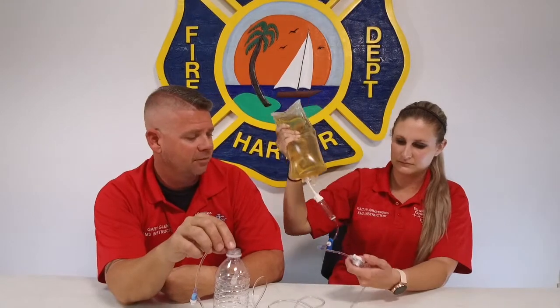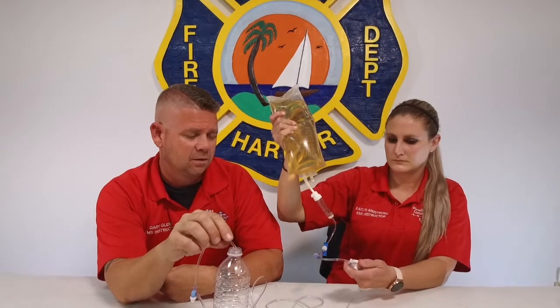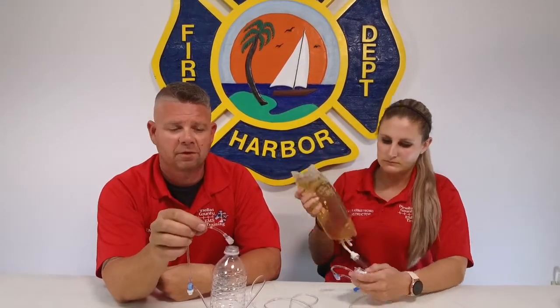Okay, so we've got that line primed now, so we can go ahead and shut that off until we get it hooked up to the patient. And then once again, we're going to perform our MAC check. We're going to verify that we're giving the right medication to the right patient. We want to talk about the desired effects that we're looking for, and this is going to be given mostly for a patient that is in some type of shock, where they're hypotensive, and we want to get their blood pressure up, okay? So we've talked about this in ACLS. If the patient's got a high heart rate and they're hypotensive, this is the medication you want to go to. If you got a post-cardiac arrest patient that is hypotensive and bradycardic, we can go with pacing first.